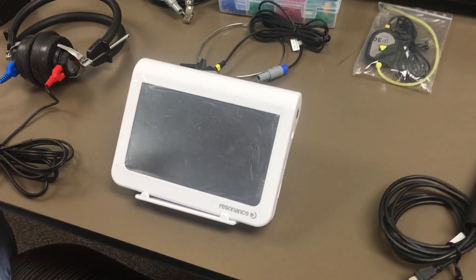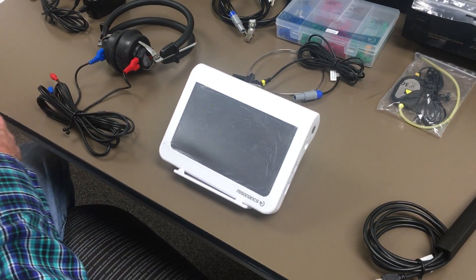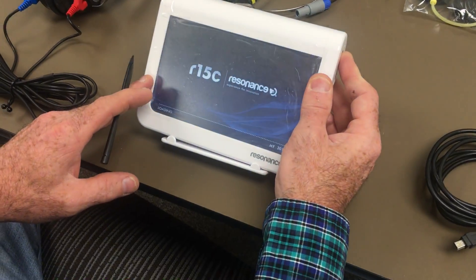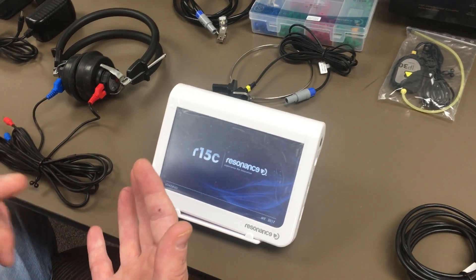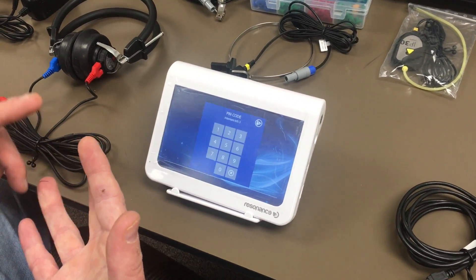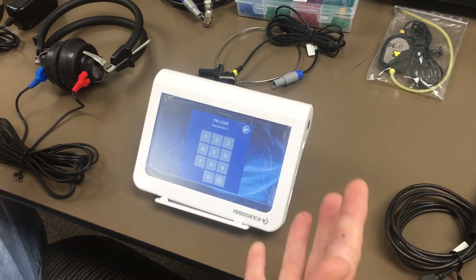Today we're going to go over the R15C T by Resonance. Resonance is an Italian company, and today we're going to talk about this specific model and what you get when you order an R15C, which is a combination of audiometry and tympanometry. There is a customization option which includes OAE, but today we're going to focus on the audiometry and tympanometry and what you get in the package.